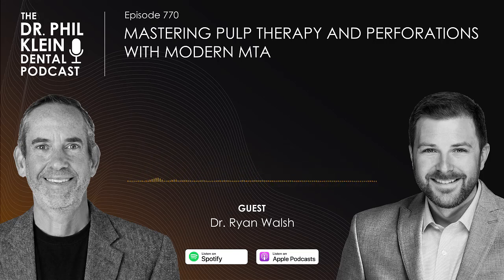That's funny you asked that question that way about the relationship between MTA and calcium hydroxide, because they're kind of inextricably related. As you had mentioned in your intro, MTA releases hydroxide and calcium ions. So MTA, for a lack of a better description, is a medical grade Portland cement with different additives, different contributions, and things like that. But really, it's a hydration reaction. It's soaking up the moisture from pulp and from peripheral tissues and using that to set. And as it sets, it's releasing calcium hydroxide.